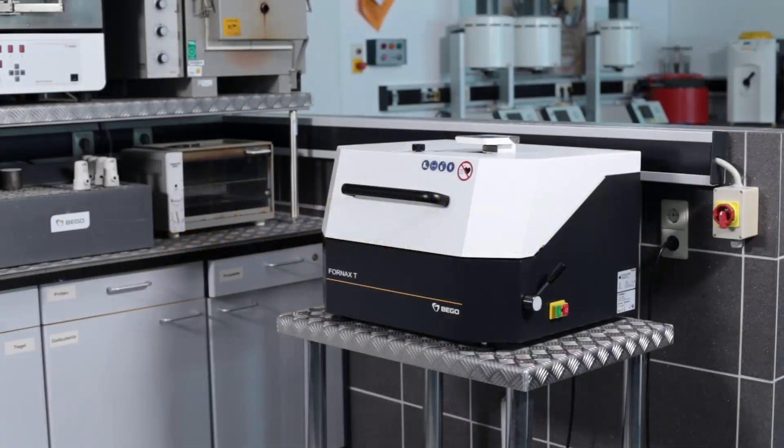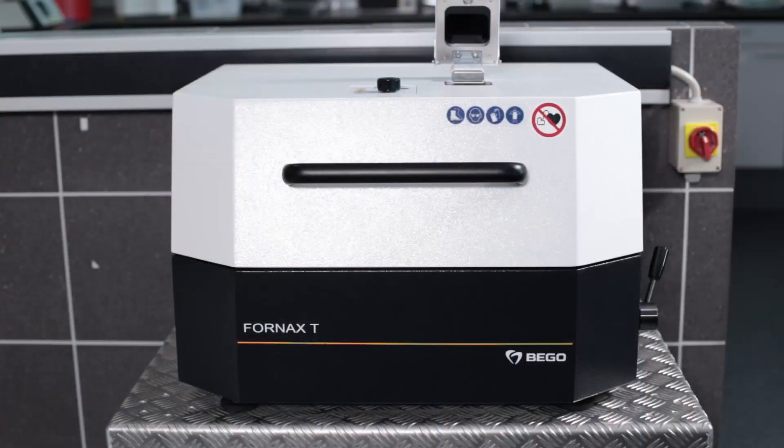The Fornax T is a casting machine that has been produced by Bego for more than 50 years and is now in its sixth generation.